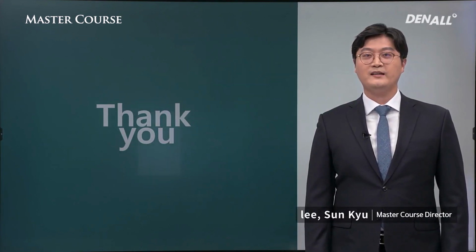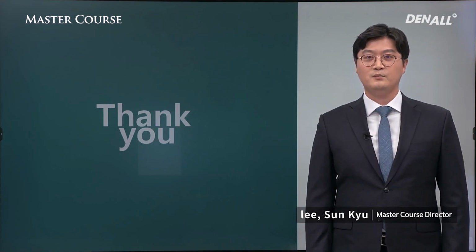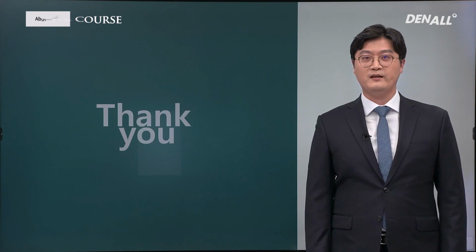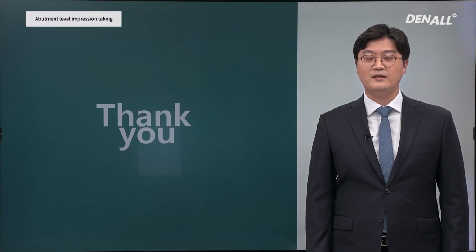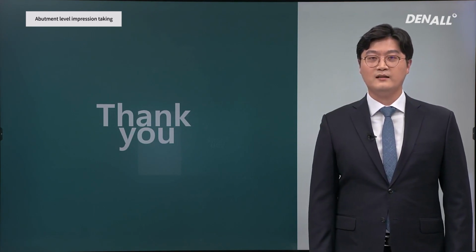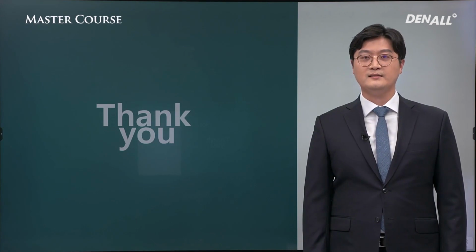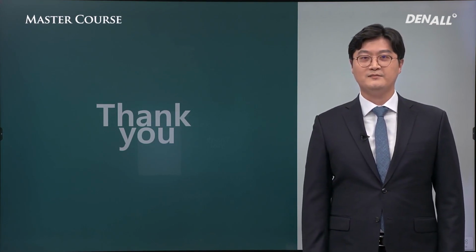Briefly, I delivered the master course online. In the offline course, more in-depth abutment level impression taking will be explained through hands-on. I believe dentists will be able to understand more accurately how to acquire abutment level impression. Thank you.